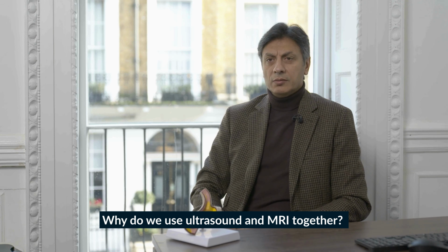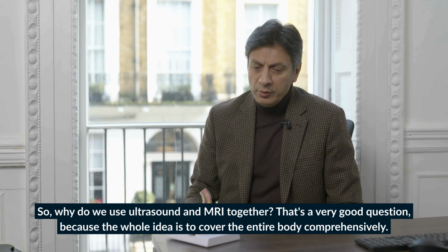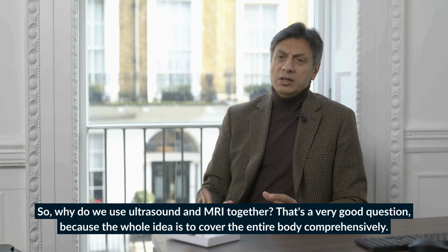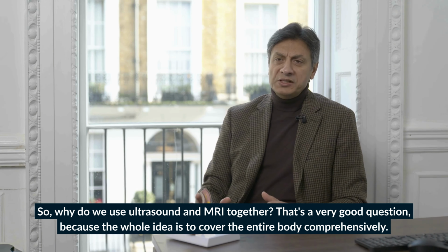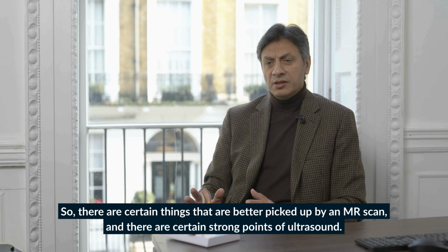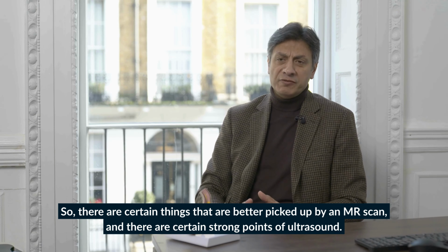Why do we use ultrasound and MRI together? That is a very good question, because the whole idea is to cover comprehensively the entire body. So there are certain things that are better picked up by MR scan, and there are certain strong points of ultrasound.